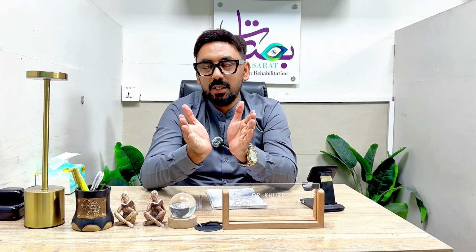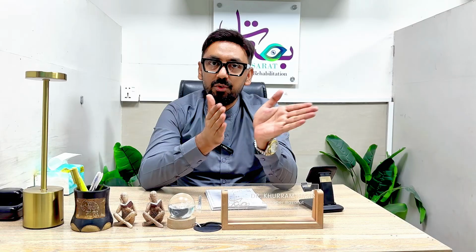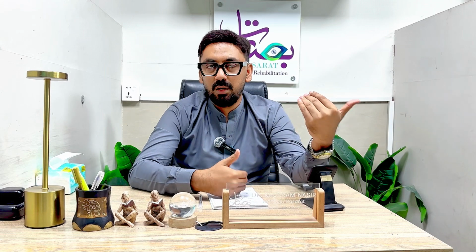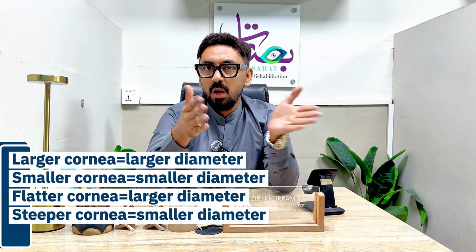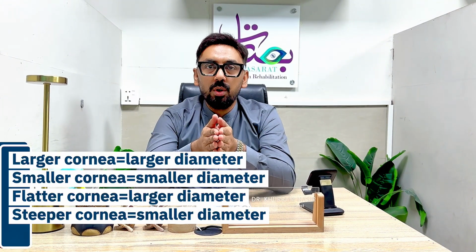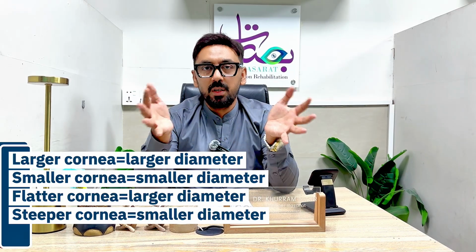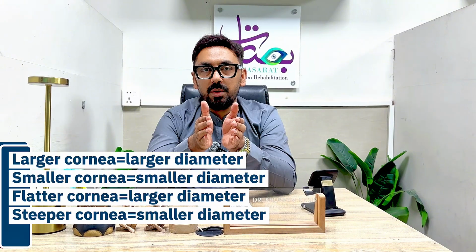So what is the difference between the soft lens and the RGP lens? The soft lens only treats the refractive errors, right? That's it. But RGP lenses treat two different things: number one, the refractive errors, as well as the corneal irregularities. So RGP lens indications are different, as we have discussed earlier. For example, if we have a larger cornea, a bigger cornea, we have to select a bigger diameter. If the cornea is flatter, then we have to select a bigger diameter. And if the cornea is steeper, then we have to select a smaller diameter of the contact lens.